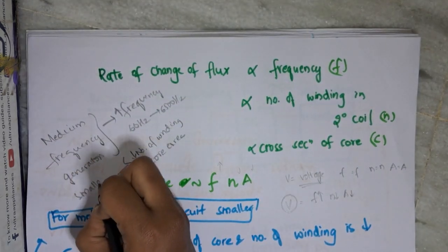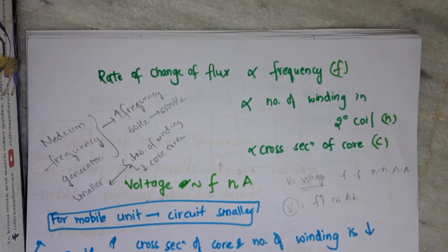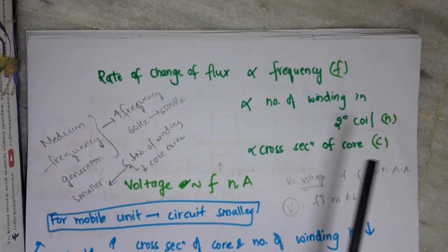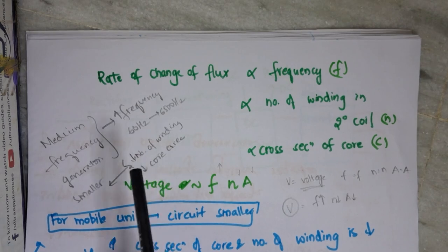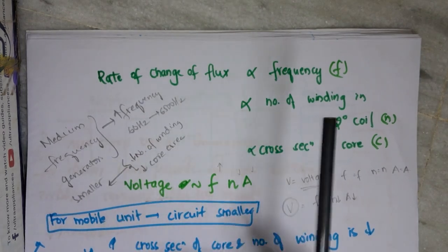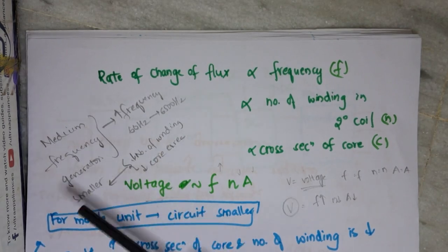So these medium frequency generators will provide a nearly constant voltage to the X-ray tube, and it is independent of the power supply. And this occurs at high frequency. It produces an efficient transformer, and it also makes it smaller. The circuit itself will become smaller.